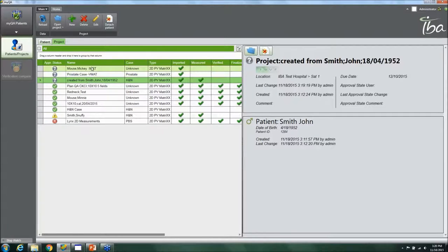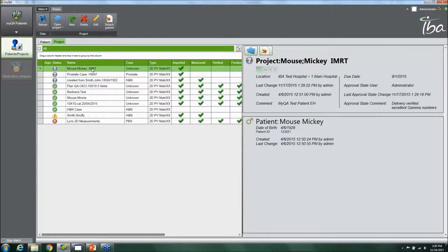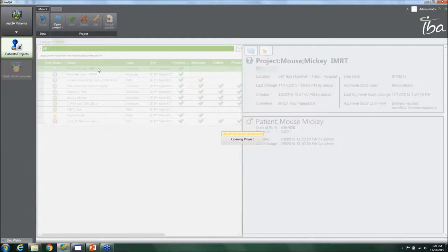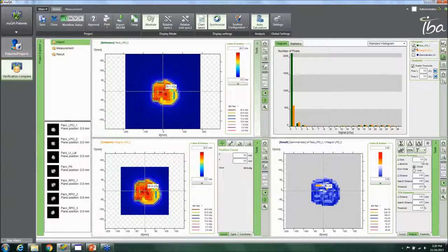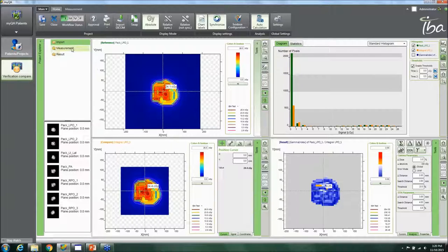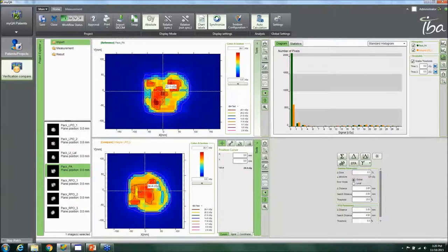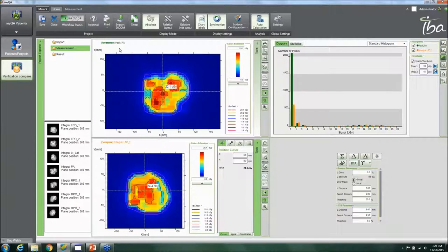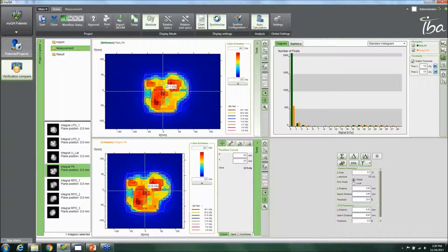Starting with a simple seven-field IMRT plan for patient Mickey Mouse, the planar doses have already been imported. Opening the project gives a nice, easy-to-navigate view. In the imported folder, you can see all the planar doses. You simply grab one, click and drag it into the measurement pane — and a helpful label shows you the reference name so you know which plane you're working with.